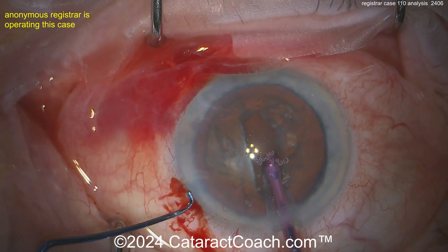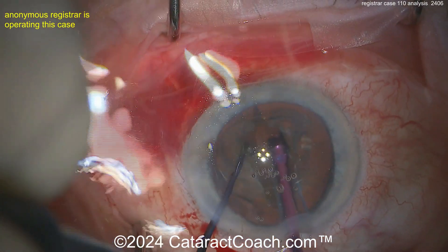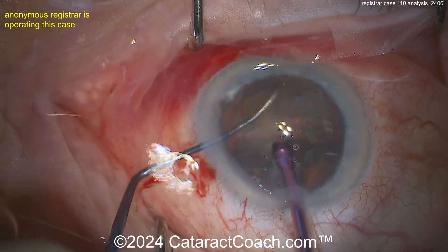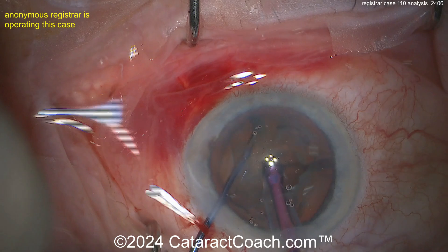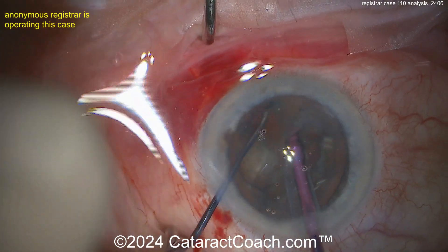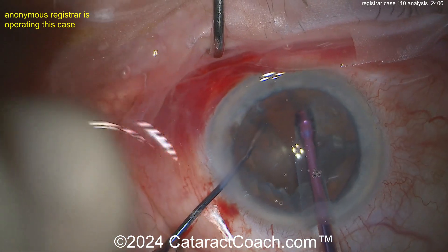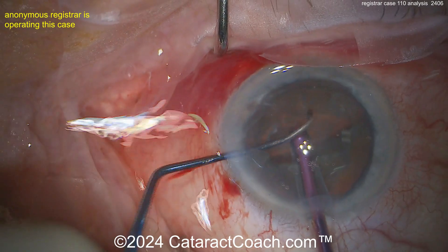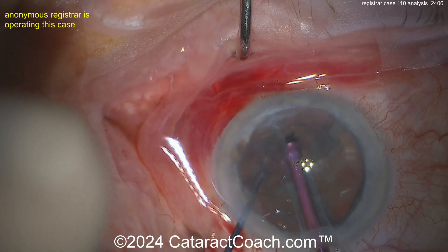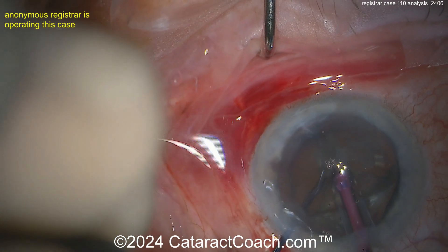Here comes the chopper going in. Get the instruments deep at the bottom of that crack and gently push apart. Good — rotate it, make sure you propagate that crack fully through. Chop! Right to chop — fantastic! Case 110, you are doing a great job. Get the eye a little bit back in primary, but seriously this is fantastic — I like everything I've seen so far.